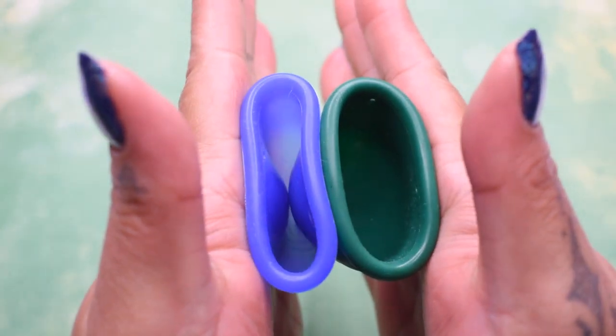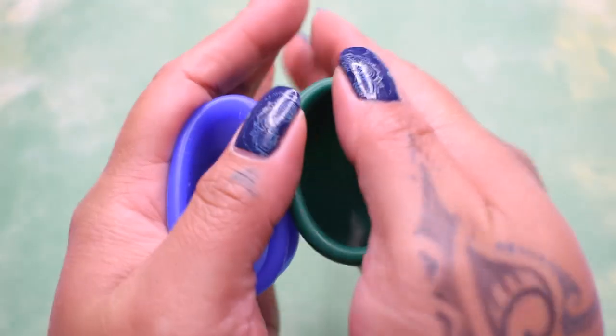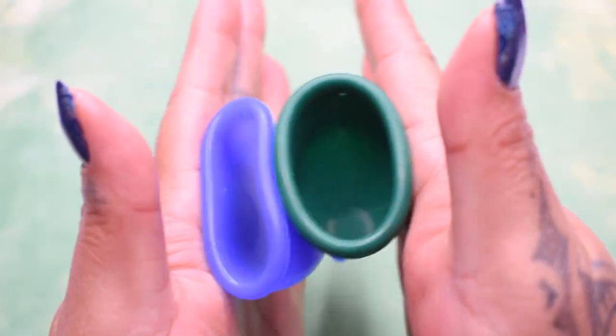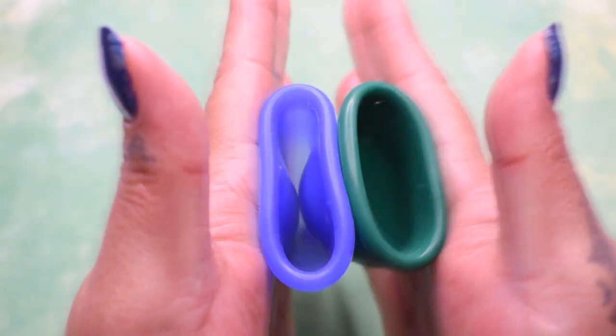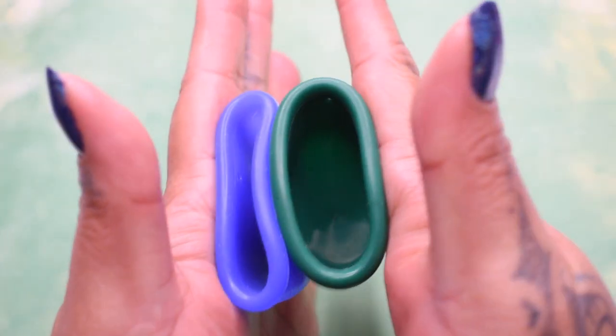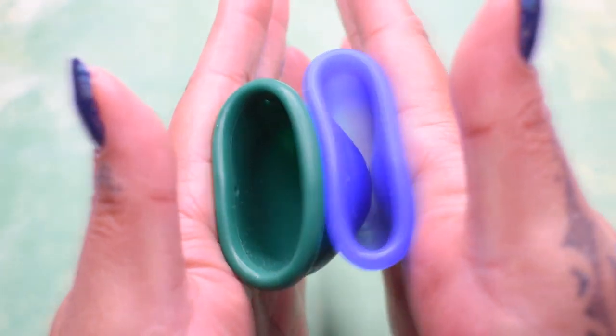Here's the inside of the soft version and inside of the firm version. Again, these are both the size small. Inside of the firm version and the soft.